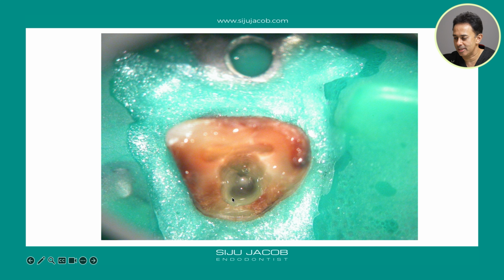So when we encounter this, what we usually do is put a drop of water in the canal, and what that drop of water does is it fills the whole access cavity, and then we look at the whole tooth in totality, and we make an assessment as to how much thickness is left in this tooth when we consider the tooth as an overall.